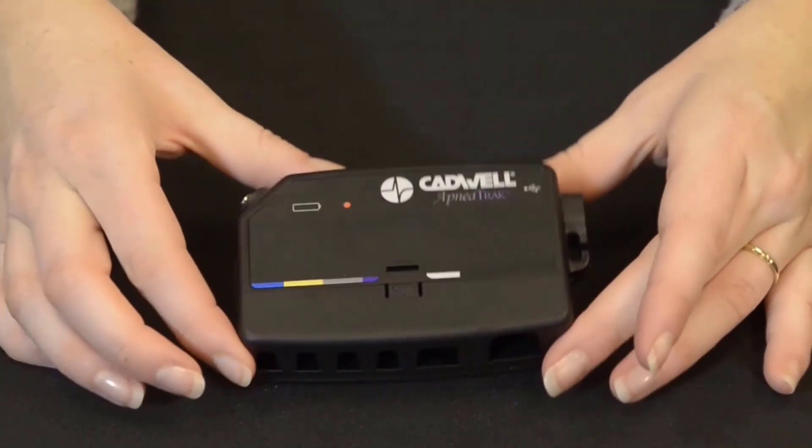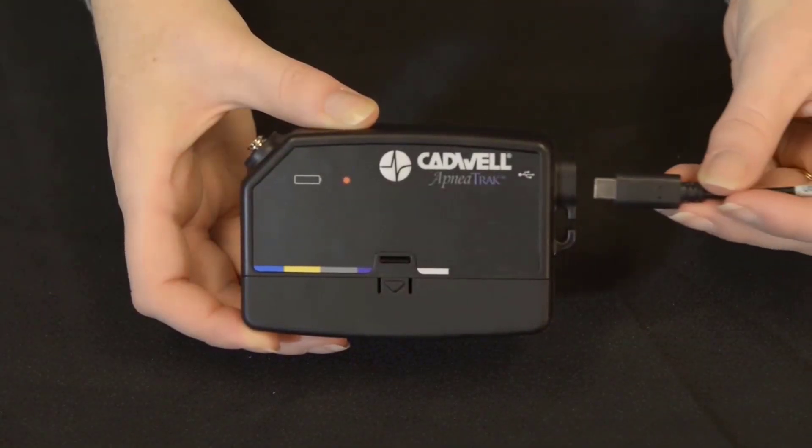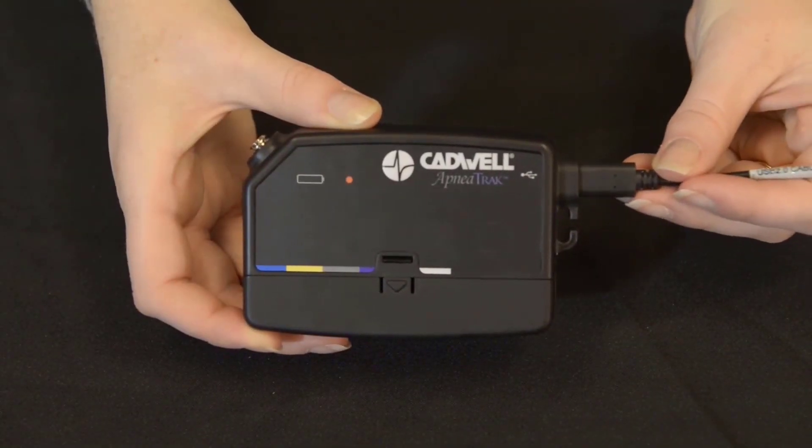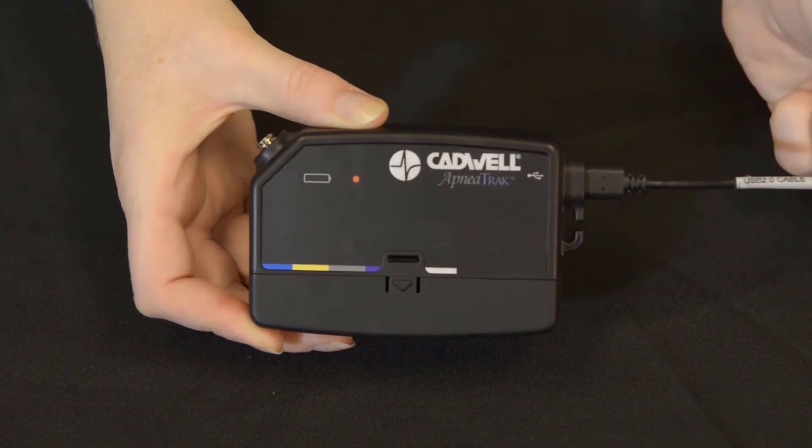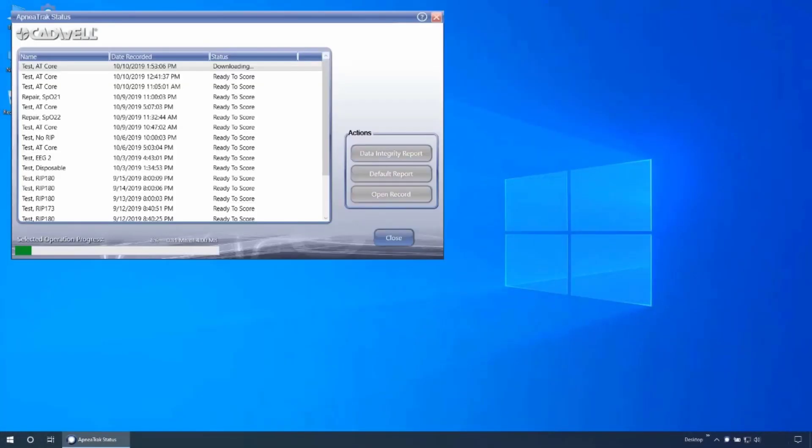Once the device has been returned, connect the device to the computer to begin download. The ApneaTrak status window will automatically open. The study will begin downloading, converting, and analyzing.